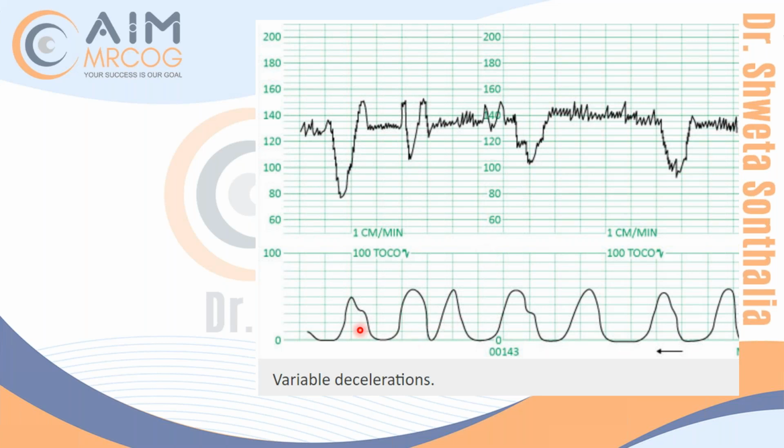I think it is coming with the contraction. I think it is a mirror image. The number of contractions is more in 10 minutes, like 1, 2, 3, 4, which is perfectly normal because anything less than 5, I'm happy. And they lasted for 60 seconds. Okay, so I don't know. Any other justification?